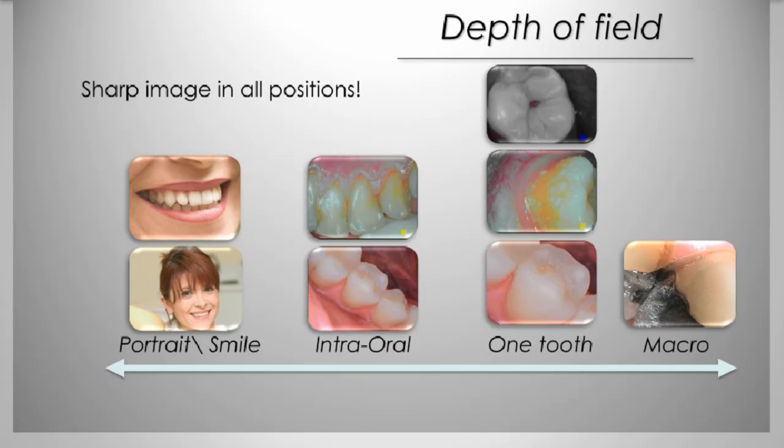It's showing that little bit of inflammation around there. Again, this patient is not too bad off. But what I love here is this black and white image with the red dot right in the middle. That helps lead the diagnosis in the direction of getting that patient the help they need, and actually advancing the minimally invasive philosophy, which is really very popular these days.